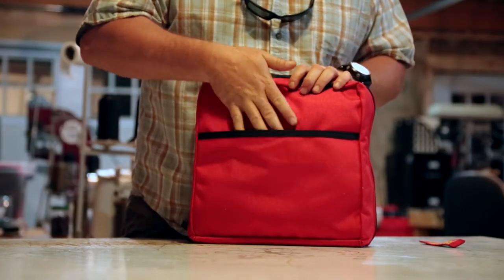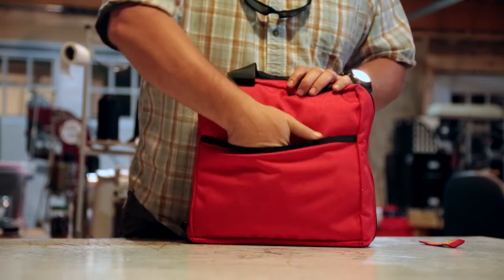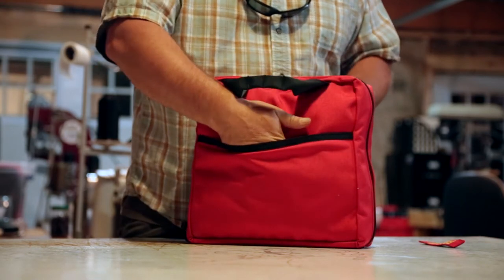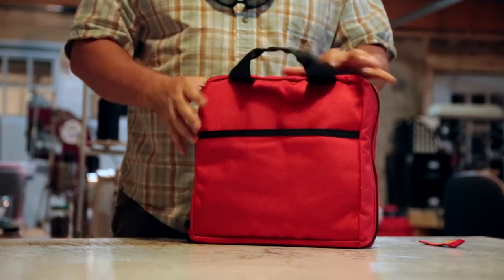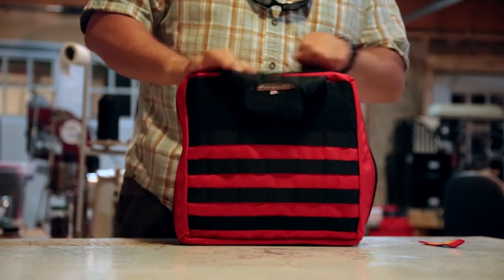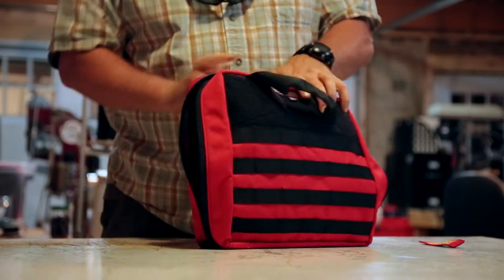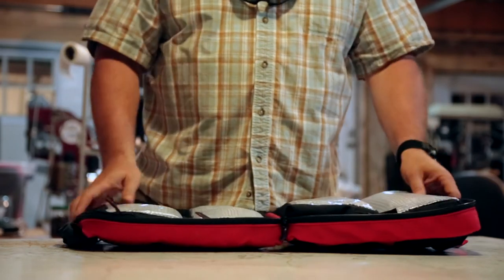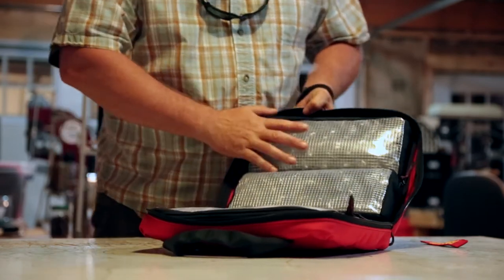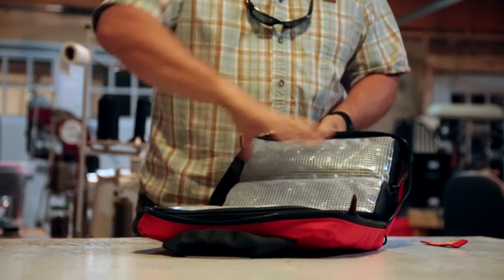In the back it's got a pouch so if you want to put miscellaneous medical information for the people on your trip — contact information — you can slide it all in this back pocket, so it's always somewhere you know where it's at and you can get to it. This is all thousand denier Cordura, and it zips three-quarters of the way around so it clamshells completely flat.